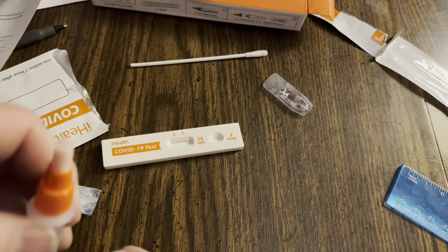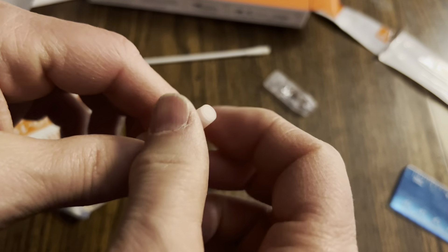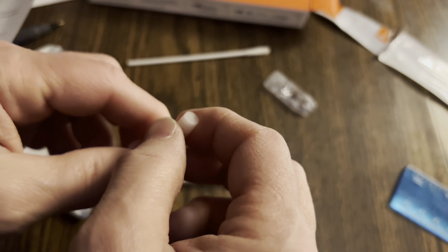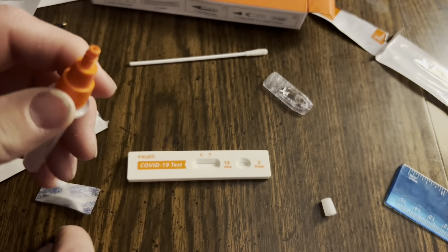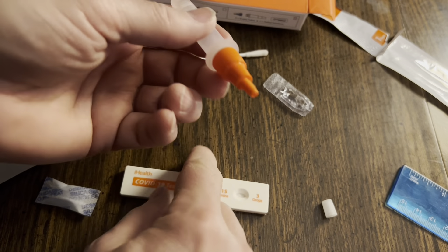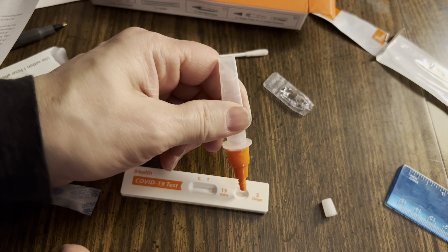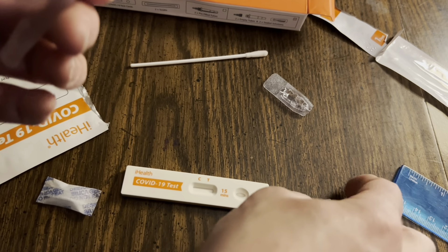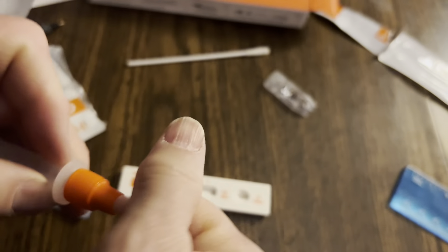Then take the cap and put the cap back on. Take the dropper cap off and apply exactly three drops — right here, no more, no less — three drops. Here we go: one, two, three.